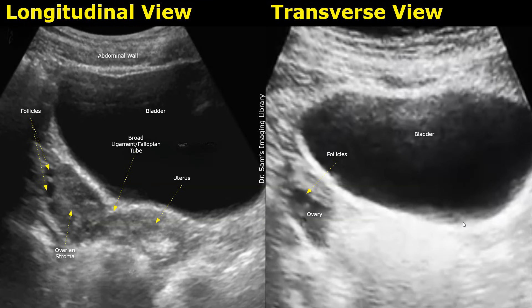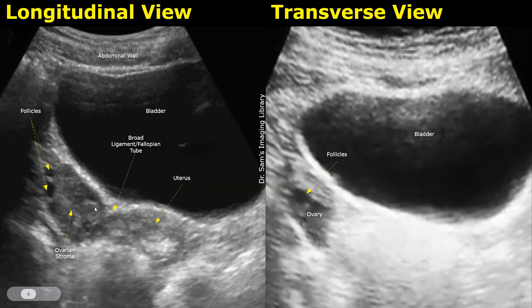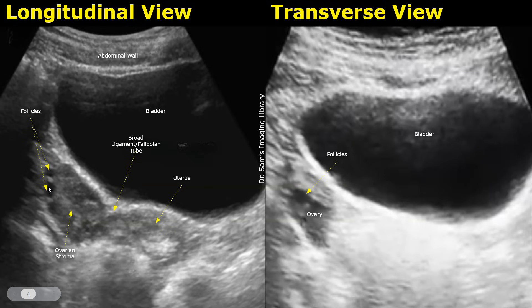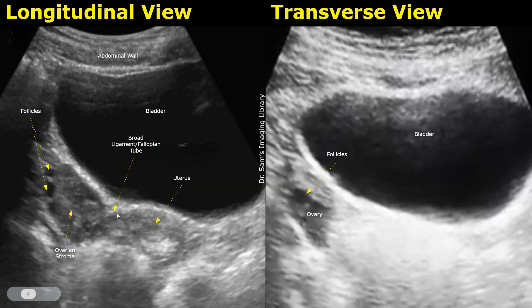This image shows a part of the uterus and the ovary in the longitudinal plane, with the probe moved laterally. This is the ovary. The ovarian stroma is the supportive tissue framework — it appears somewhat homogeneous and a bit hypoechoic compared to the uterus. Anechoic rounded follicles are seen within the ovary, making it easier to identify. Between the ovary and the uterus will be the broad ligament and the fallopian tube, which are not visible; in normal cases, the fallopian tubes are not seen on ultrasound.